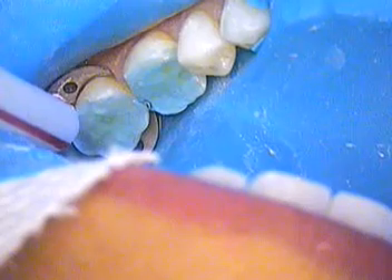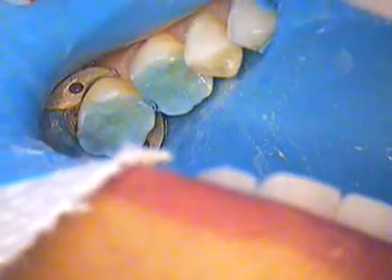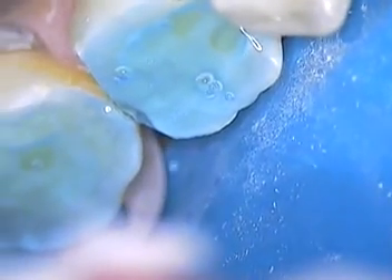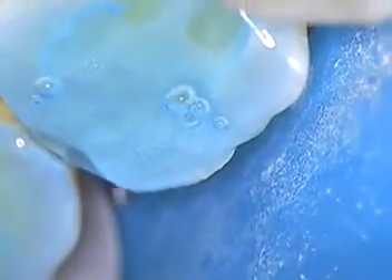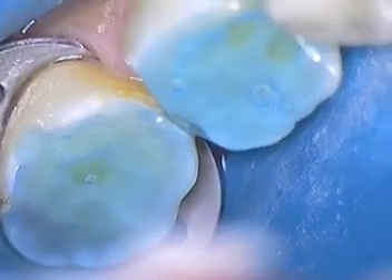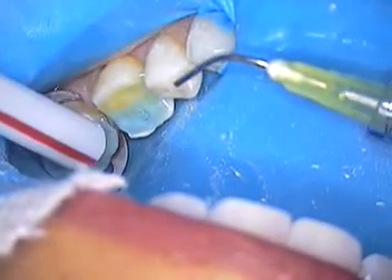Now we talked before about the carbon dioxide bubbles. I'm going to bring up the light so we can focus in on the bubbles — you can see them. That's the dentin getting a chemical reaction with the etch. We're just about ready to rinse that off, so suction back on again, and we'll start rinsing all the way in the back.